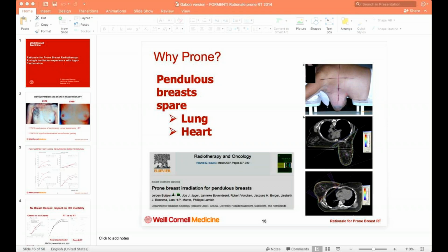If I have scars that extend to the posterior axilla, I feel like any scar has to be covered. So that's one of my basic tenets of radiation therapy treatment. It's problematic because maybe the surgeon doesn't have oncologic experience, and that's why the scar is extending that far.